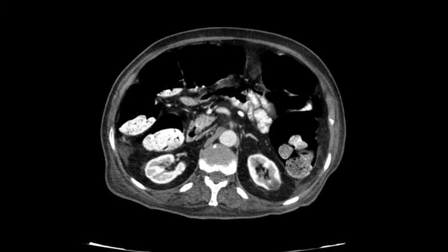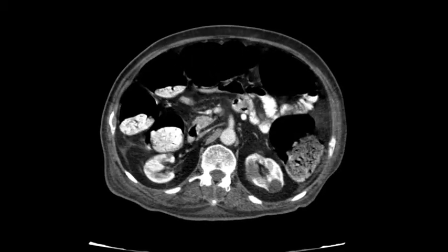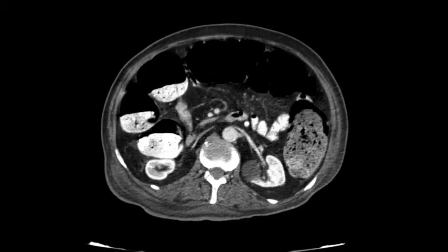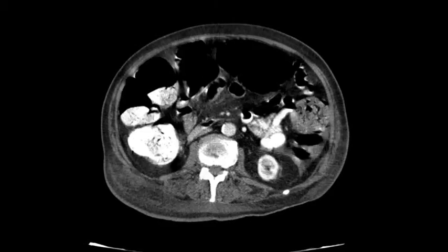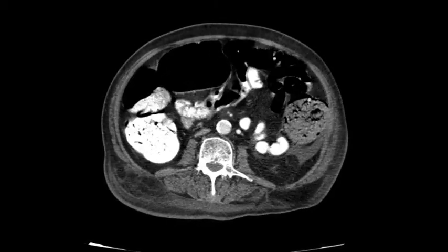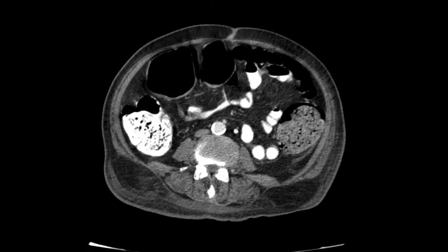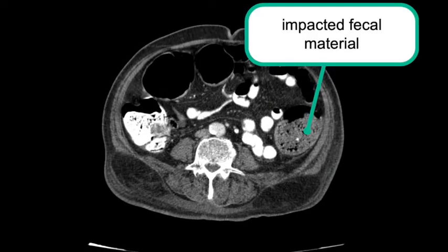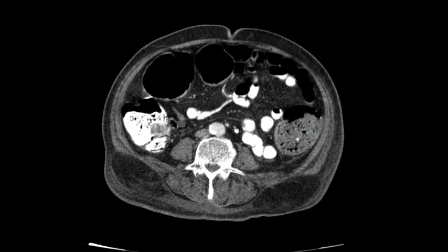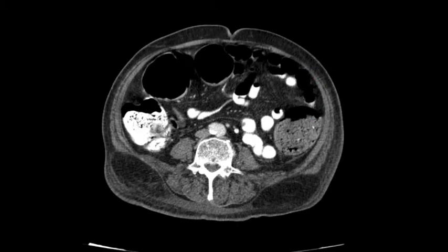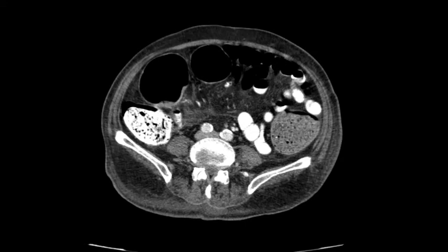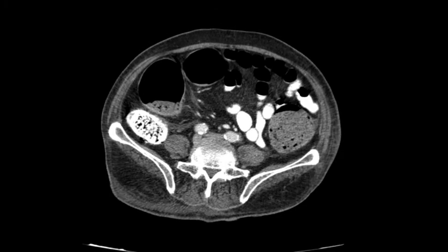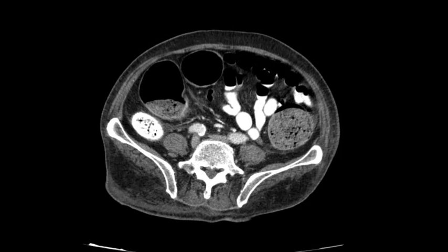As we scroll down we can see some simple cysts, especially in the left kidney, and you can see how fecal material is impacted within the dilated bowel loops. The large bowel loops are dilated and full of fecal material.